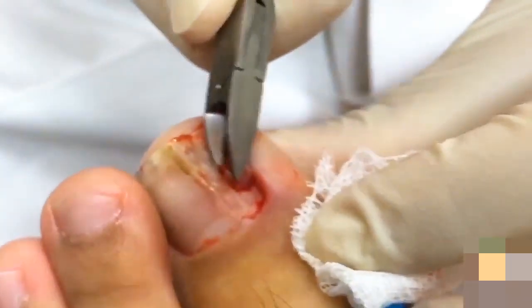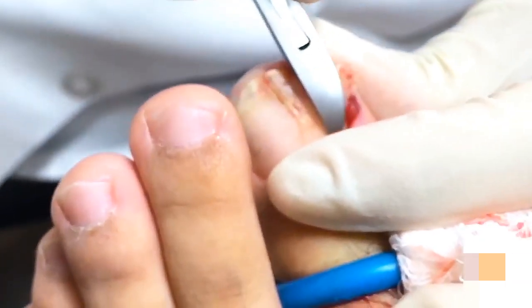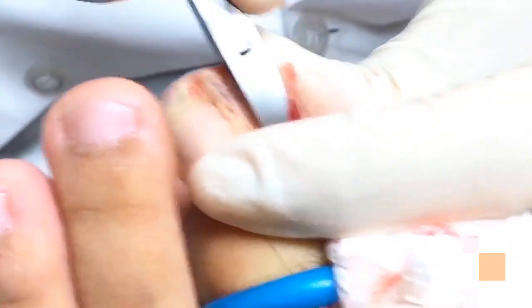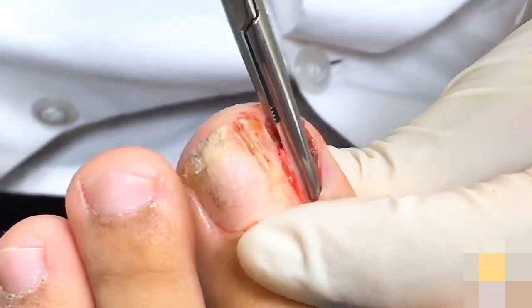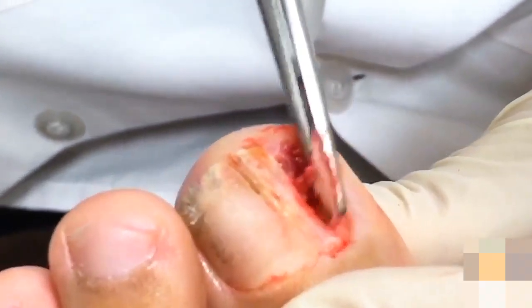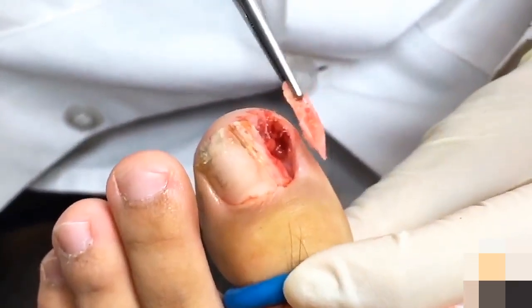It's quite bloody, so I don't want to take too much of it, but I'm going to have to take some because it's going to get in the way of me doing a good job — taking a chunk off all the way down to the base of the nail and then removing it. Take this whole part out. This is a pretty good size nail, as you can see.